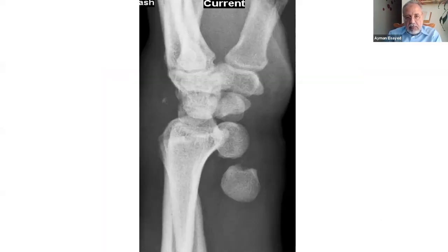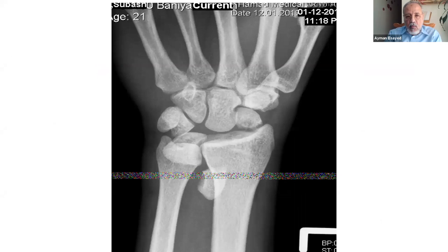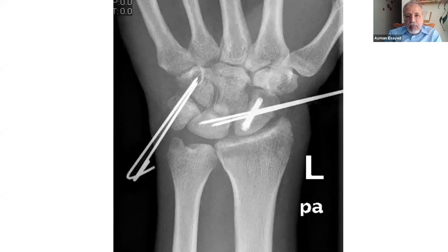Another case of lunate dislocation, transscaphoid. The patient had median nerve compression symptoms as soon as he arrived in the emergency and he was taken directly to theater. The median nerve was decompressed and the bone fragments of the scaphoid and the lunate were reduced through the rent of the capsule. The scaphoid fracture was opened, so we had to fix it with 2 K wires. The scapholunate ligament was also repaired and stabilized with another 2 K wires.